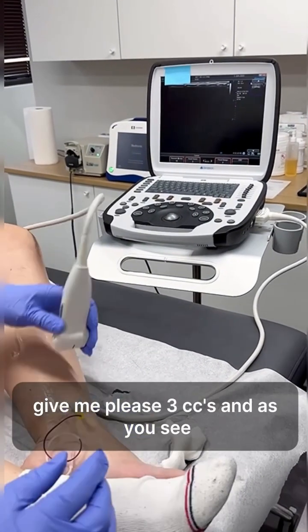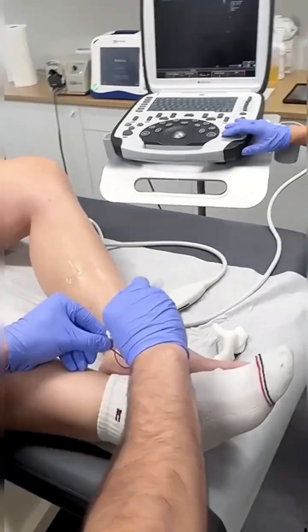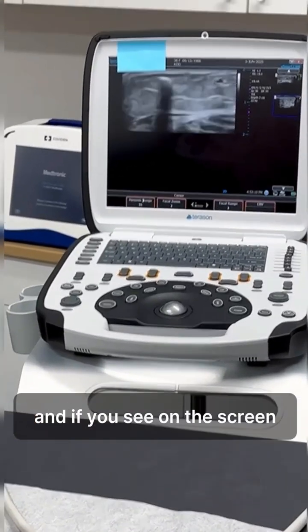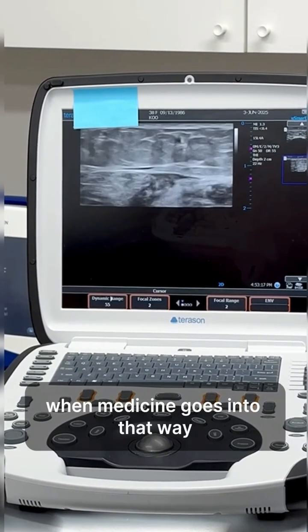Give me three cc's please. As you can see, it's a very high pressure vein — the blood is coming so quickly. And if you look at the screen, one of the black ones becomes whitish when the medicine goes into that vein.